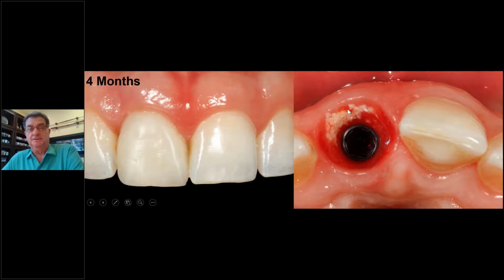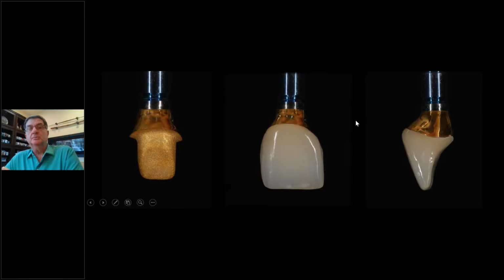Now the tissue was thick, but these particles, the good news, it didn't work out the buccal, but it's coming out the sulcus. In fact, see this little spot? See that little spot here? That is the same spot as you see here. You don't see it. It's the same day. It's right there, right there. That's that little spot. It's working its way out. So Steve said, should I take it out? I said, no, leave it alone. We kept going.